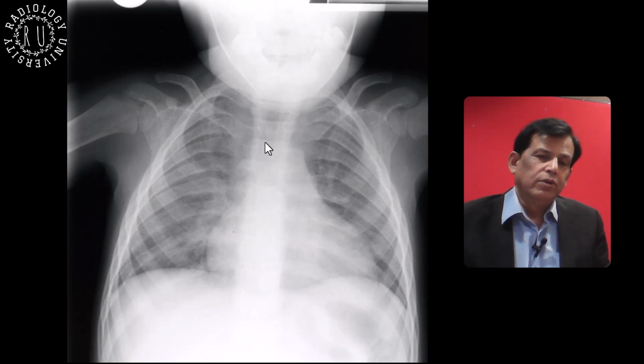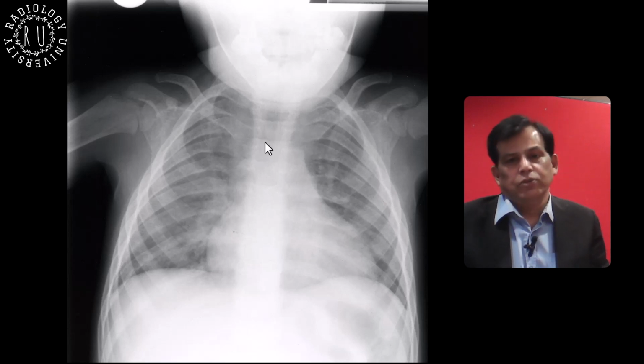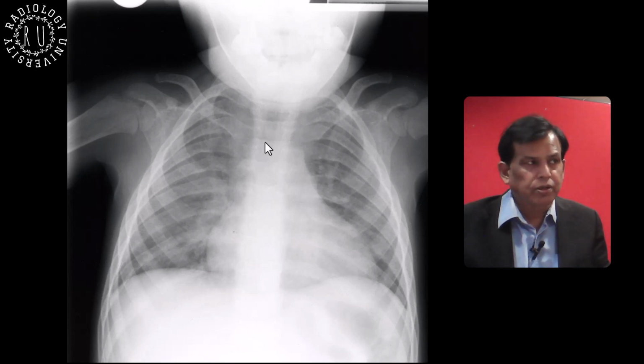They need a lot of blood transfusion because they don't have enough good red blood cells for oxygenation. So hemosiderosis develops. The marrow is trying to produce more, so the bones get more widened. Is that what you're thinking here? Do you know what they get in the skull at this age? The hair on end skull appearance.